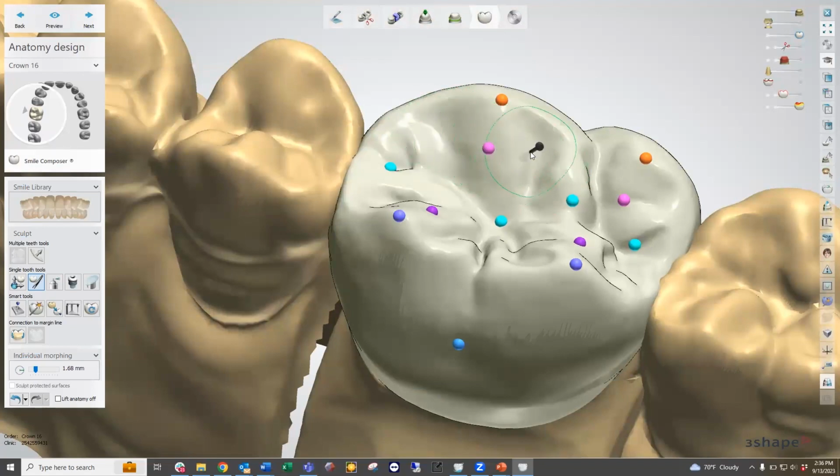And the arrow just basically allows us to move in 2 dimensions, just straight up towards us or straight back. And no matter where the arrow is pointing, we're only going to be dragging our cursor, or the mouse is only going to be going up or down, straight up and down in a line. If I go left and right, it's not going to do anything. So I'll show you here in demonstration.